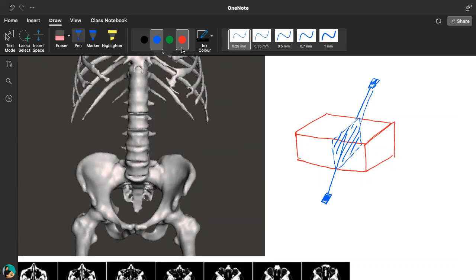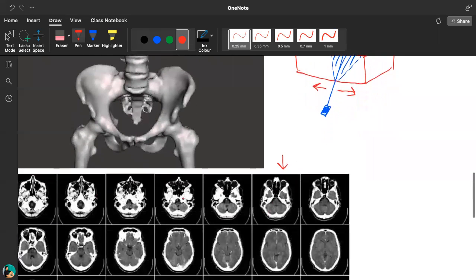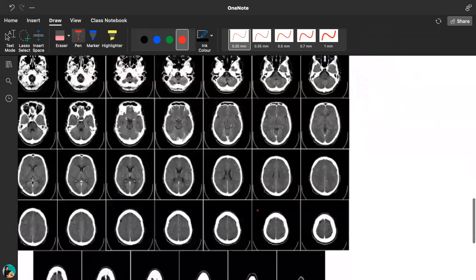And when this moves, here it moves left and right. Once it moves, then you scan the next slice. Every single slice, they record the image. So what you see in this picture here, you see very similar pictures, right? Let's say this one.